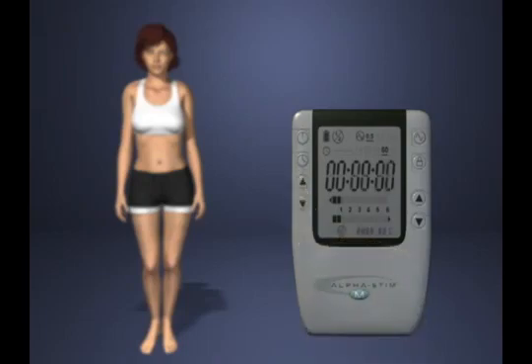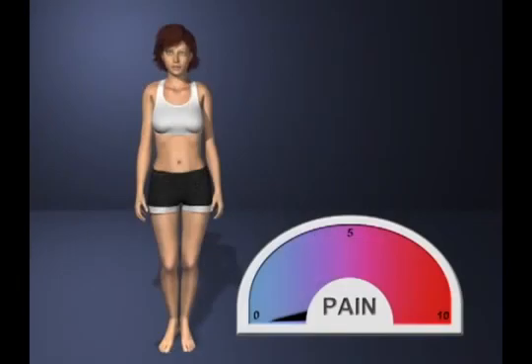Of course, you may increase the current as necessary to obtain pain relief, but it is better to reduce the current to 100 microamperes if possible when using the Alpha-Stim for long periods of time. Note the level of your pain for all areas being treated and any limitations of movement in joints before, during, and at the conclusion of treatment.